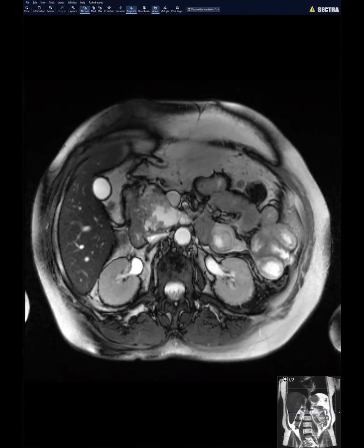Exactly, we do. So if you have that workflow, I would say if you have prior scans and it's 3 millimeters, I mean, it's a judgment call at some point, but all those small lesions in older patients, I would definitely put them into a non-contrast abbreviated protocol, regardless of COVID. And the ones that are more on the move, or if you don't have any prior imaging showing any kind of stability, that's where I would do a full scan.